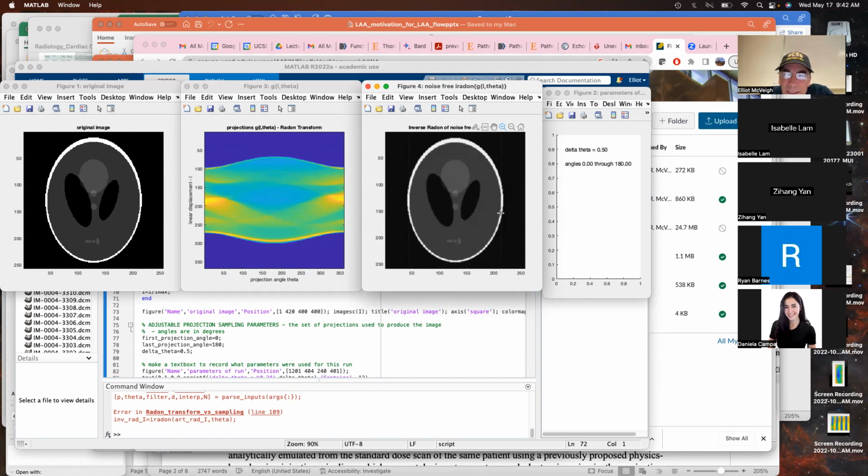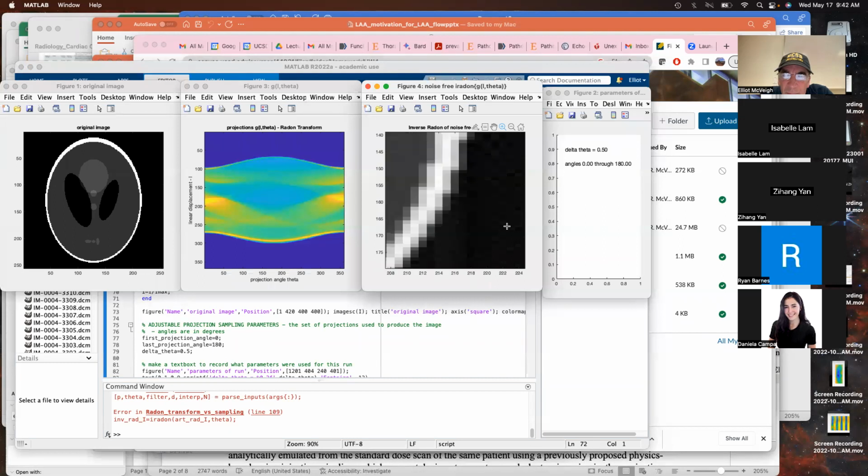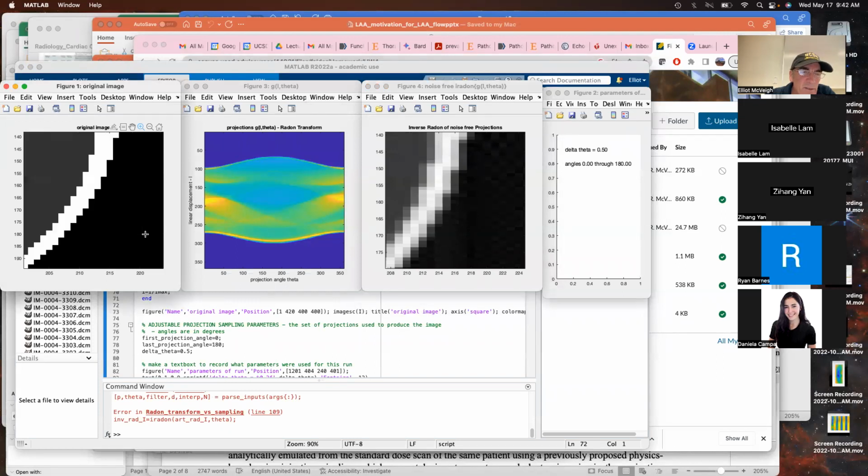And you can look at the details back here, compared with what the actual edge is. It looks like that. So there's still some blurring on there.